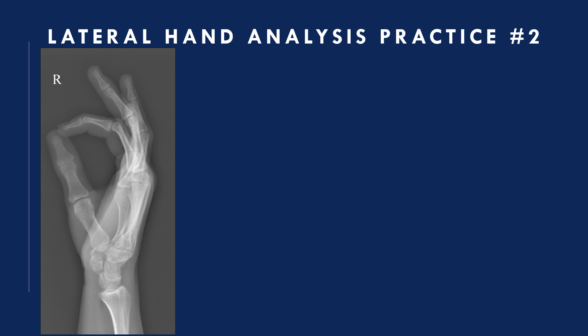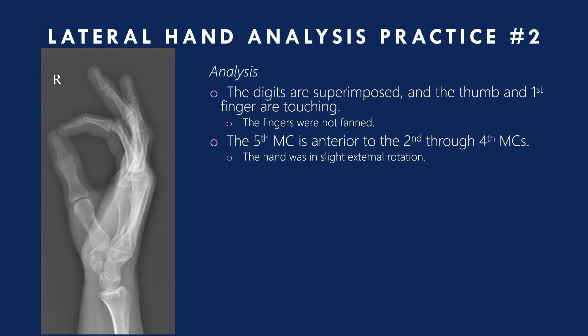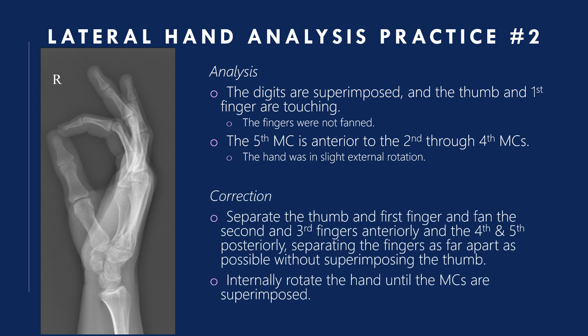Lateral hand analysis practice two: the digits are superimposed and the thumb and first finger are touching — the fingers were not fanned. The fifth metacarpal is anterior to the second through fourth and the hand was in slight external rotation. Correction: separate the thumb and first finger, fan the second and third fingers anteriorly and the fourth and fifth posteriorly, separating them as far apart as possible without superimposing the thumb. Internally rotate the hand until the metacarpals are superimposed.